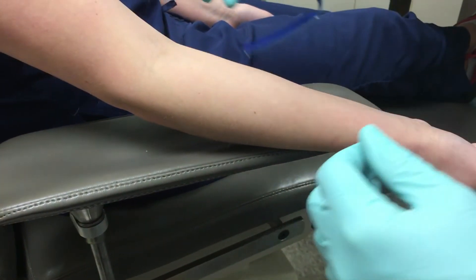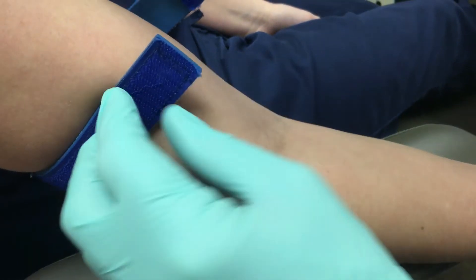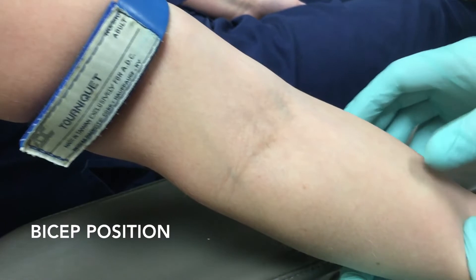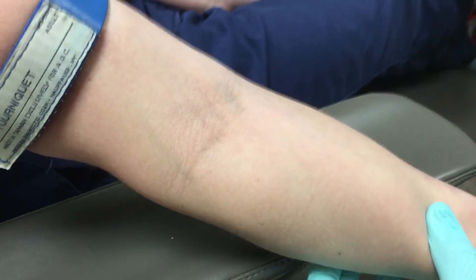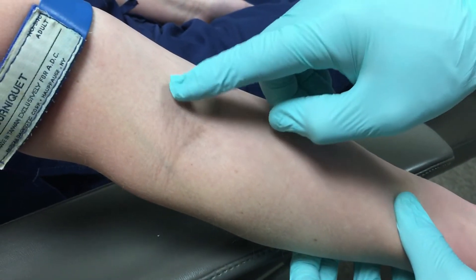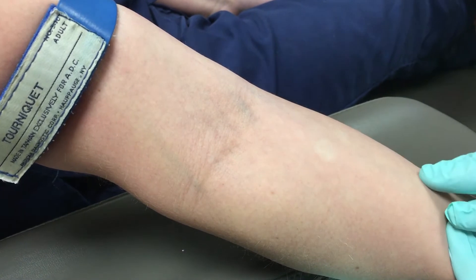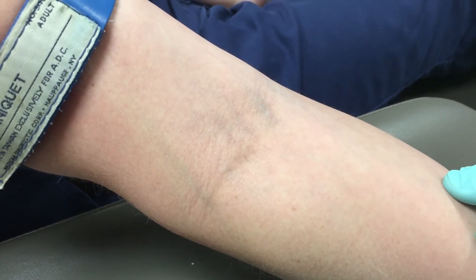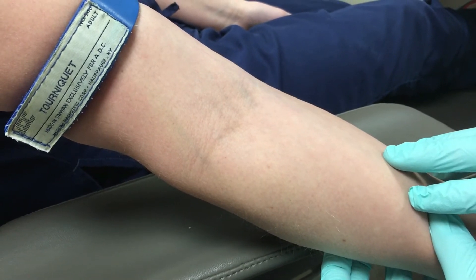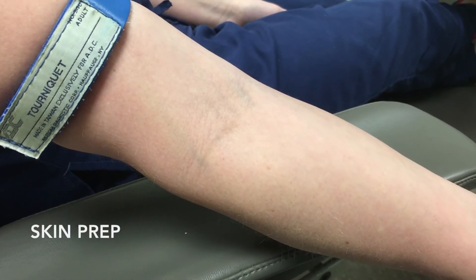The first thing we're going to focus on is tourniquet placement. If I'm going to the AC, I'll go up around the bicep. I'm going to have the patient squeeze their fist, which will help pronounce these veins. As you can see, we've got a couple of veins we can look at. I'm going to have Kristin hold steady here — I'm not going to do a needle stick on her or an actual blood draw, but I am going to go through the steps and show you how I would do so.